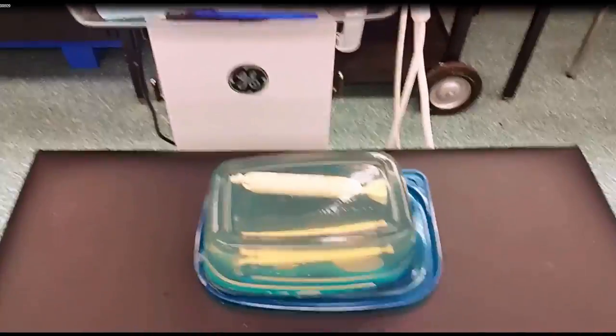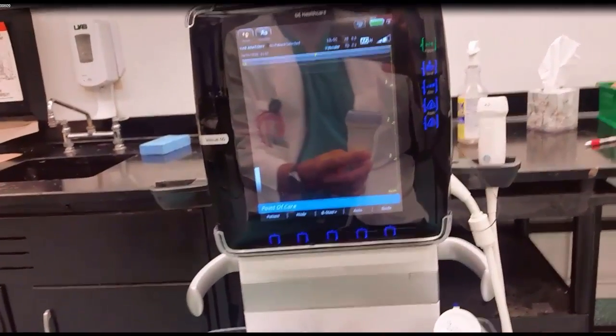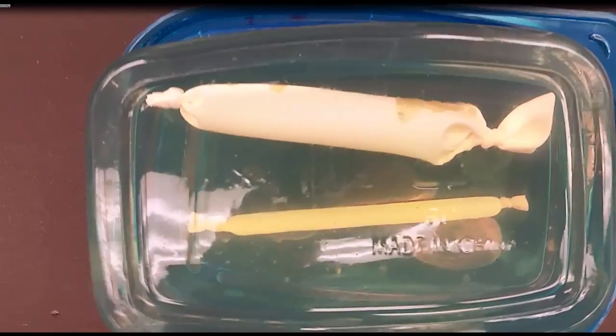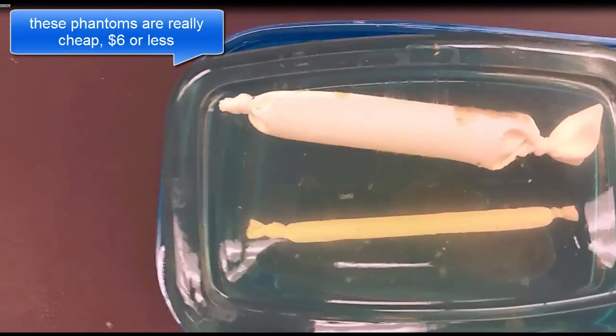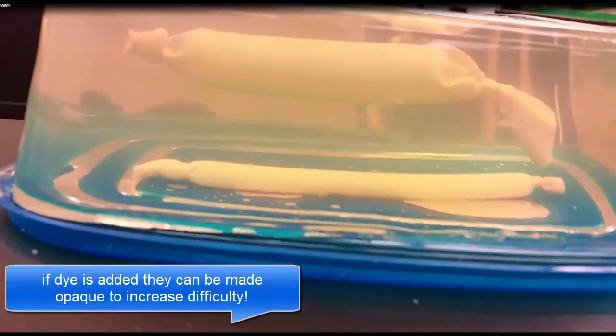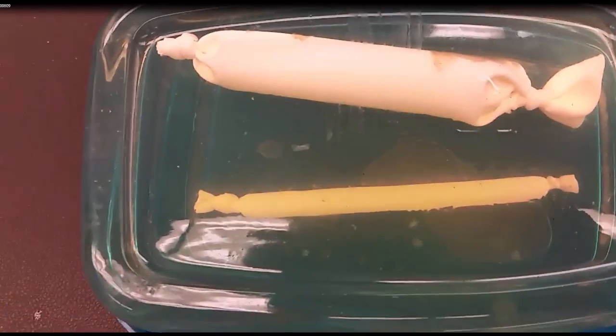Okay, so now let's do some real scanning. We're going to be using the high-frequency probe, we're going to use the GE Venue 40 system, and this homemade so-called ballistics gelatin phantom. What I use is, as you can imagine, ballistics gelatin. I've embedded into this little block of gel two structures. These are both Penrose drains. On the top is a 1/2 inch, and on the bottom is an 1/8 of an inch Penrose drain.